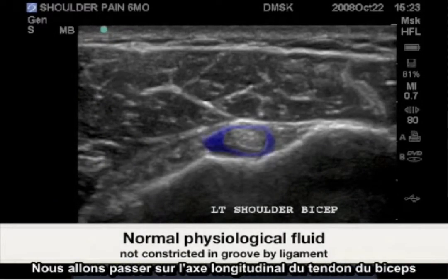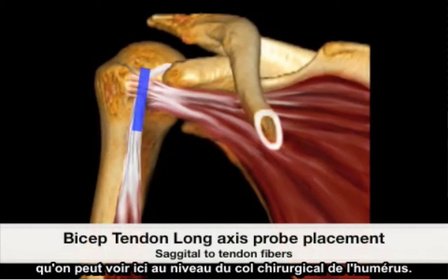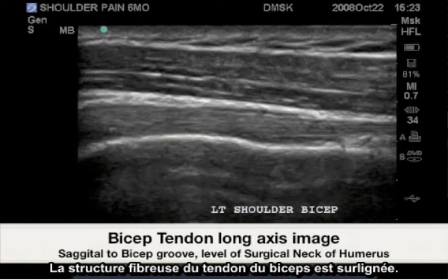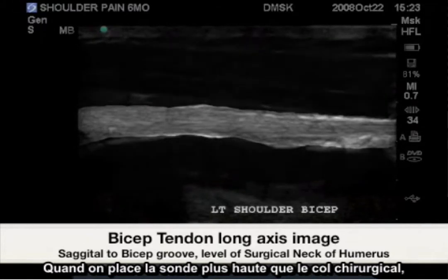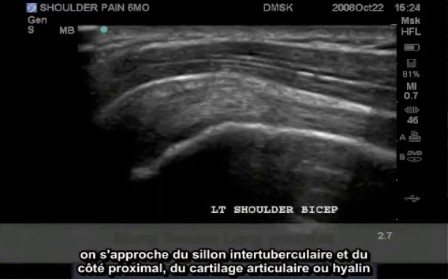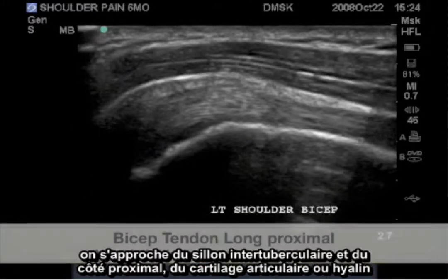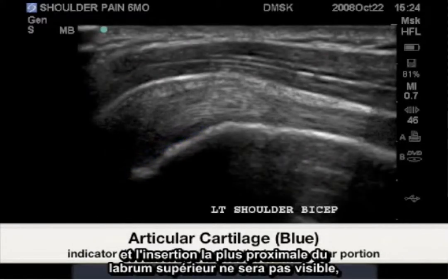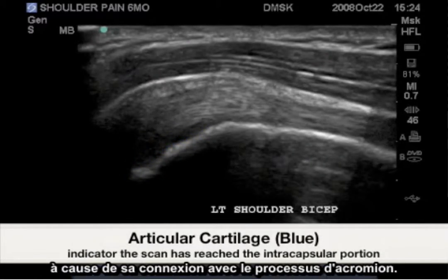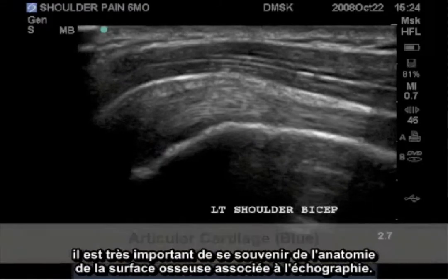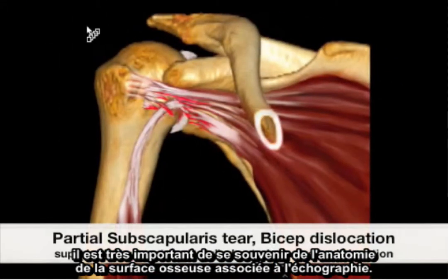We now turn to the long axis of the bicep tendon, shown here at the level of the surgical neck of the humerus. Highlighted is the bicep tendon fibrillar pattern. When the probe is placed higher than the surgical neck, we approach the bicep groove, and proximal to the biceps groove, the articular hyaline cartilage and the very proximal insertion to the superior labrum will not be seen due to its relationship beneath the acromion process. When pathology presents itself, it is very important to remember the bony surface anatomy associated with ultrasound.